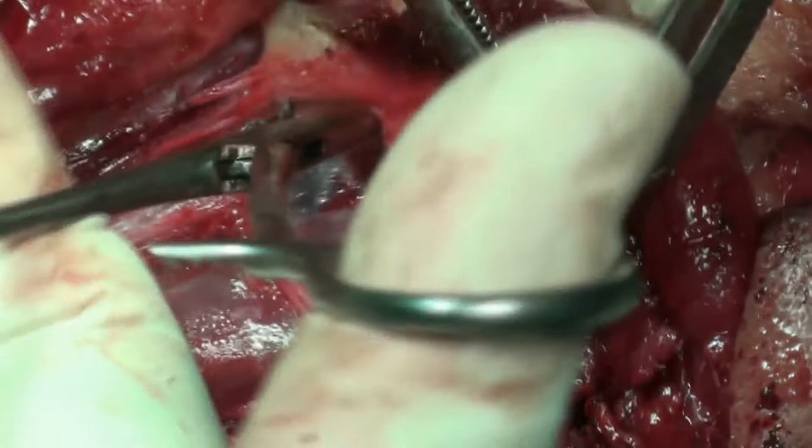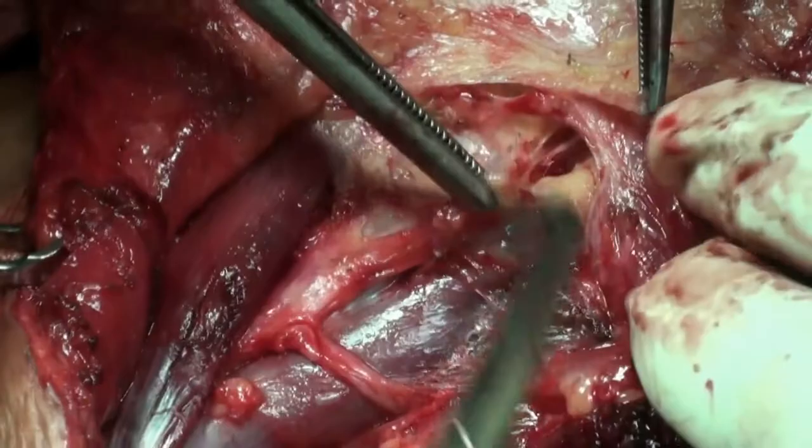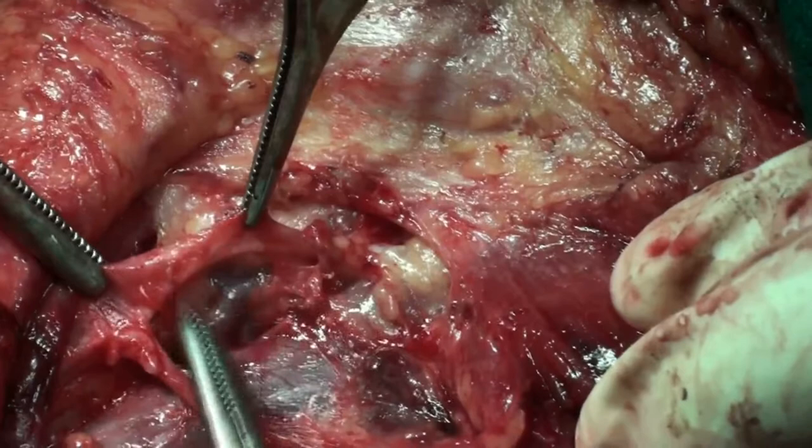This will actually be the ansa hypoglossi. It comes down and is joined by the cervical plexus to form the ansa cervicalis. If you trace it up, you can reach the hypoglossal nerve. So this is ansa hypoglossi descendens, as they call it. So we'll try and create some space and tie it. Good. Creating some length so that I can handle.